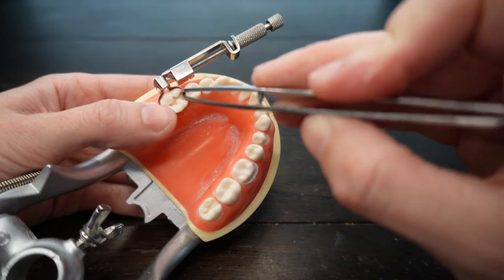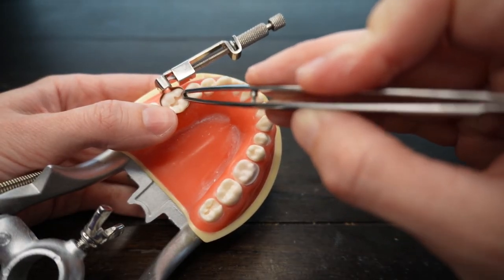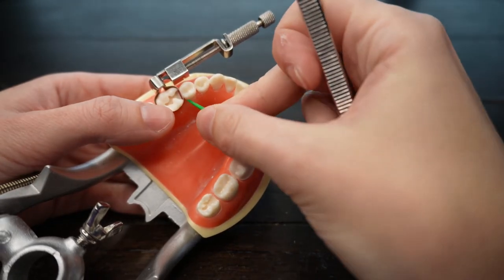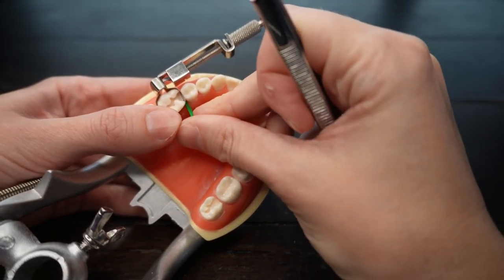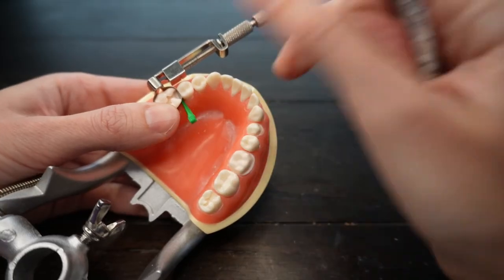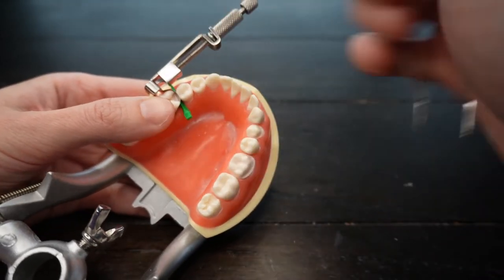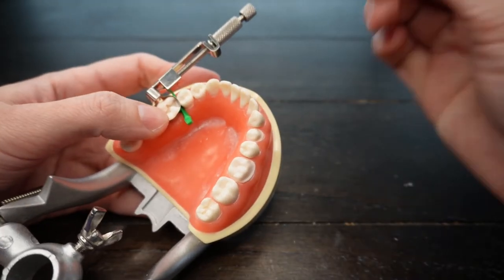But we still see the gingiva here, right? The pink, there's not supposed to be any pink. So we're gonna place a wedge. I'm gonna insert the wedge and, yeah, you can use pliers for that. And here you go.